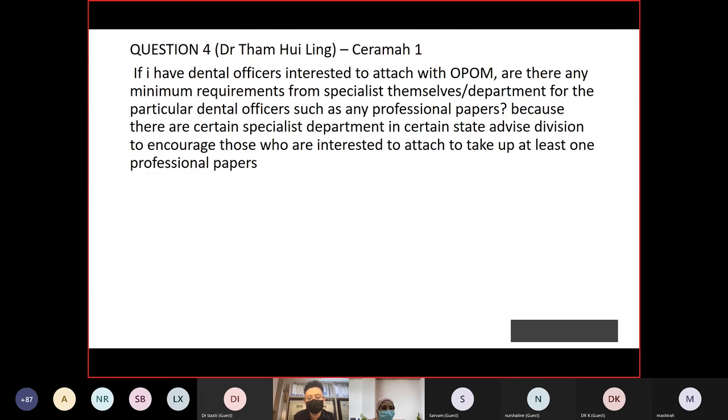Justin Ling's question lah. But from our jiran, OS kan, so that one should be okay lah kan? Yeah. It is next door. You don't really need the full packing up, but make sure that when you transport to the lab, all the bottles are transported in a container lah, yang bertutup. Sebab that's the SOP in most hospitals lah.